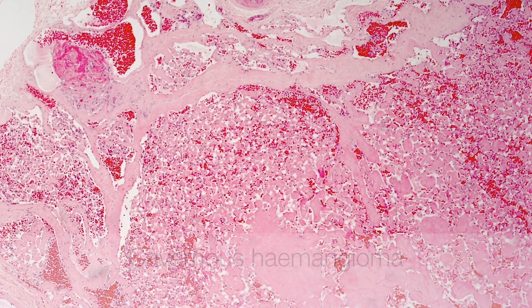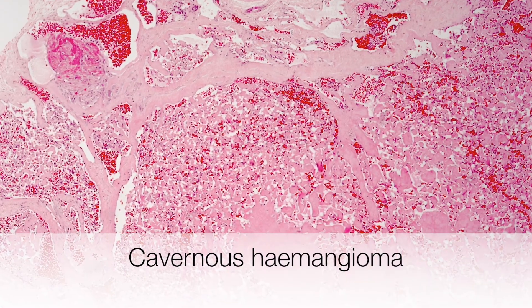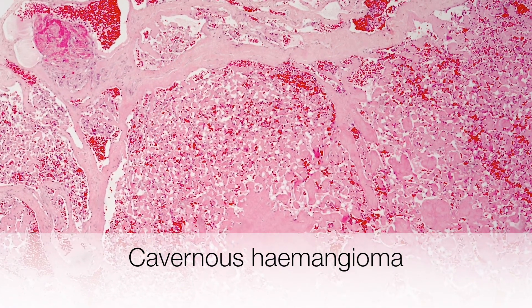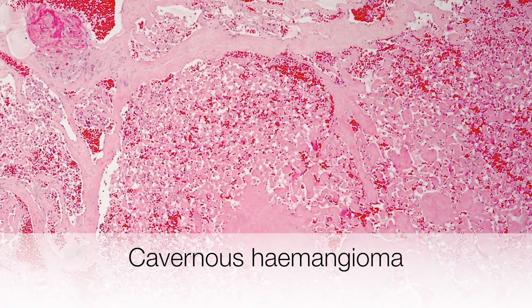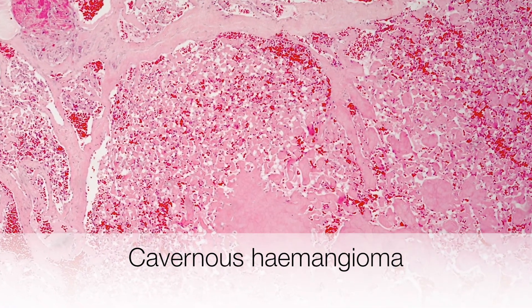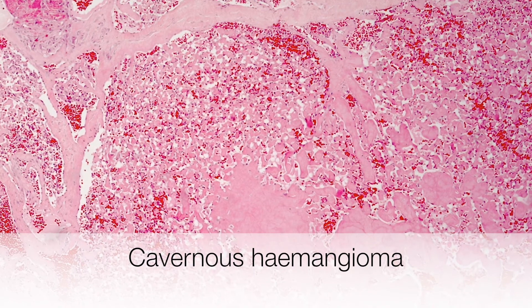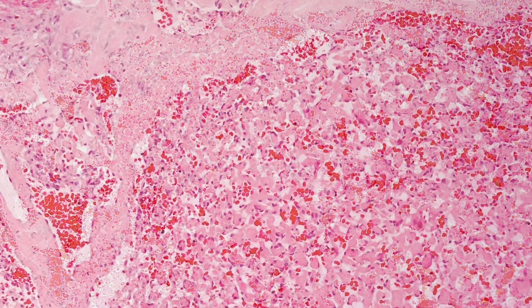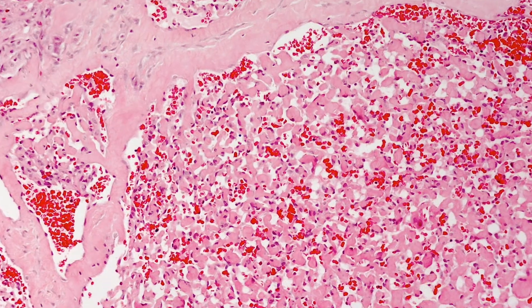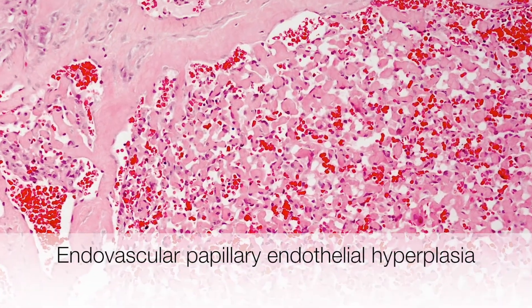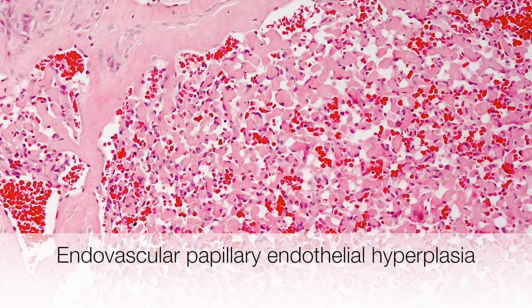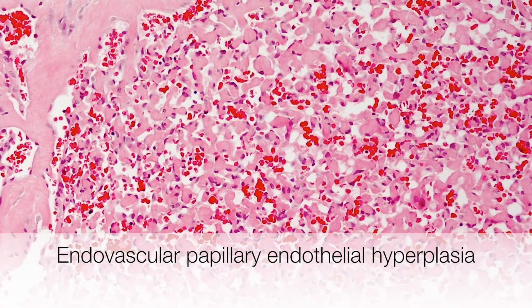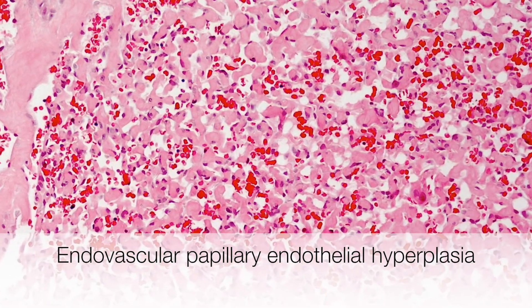This is an example of endovascular papillary endothelial hyperplasia that has arisen within a cavernous haemangioma. Hyaline papillary structures can be seen within the cavernous spaces.